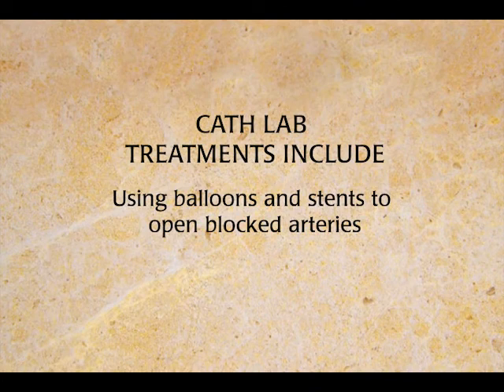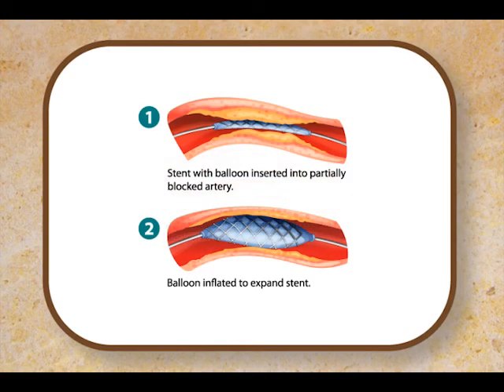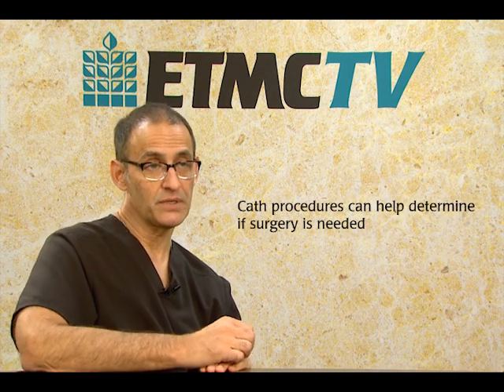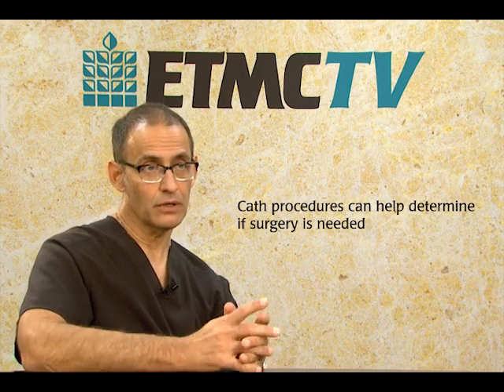If a patient comes in and is having chest pain, they've got a pretty typical history. They have maybe a stress test beforehand that shows that the front wall of their heart is deprived of blood flow. If you saw a high-grade blockage in that artery and it looked like something that was appropriate to fix with a balloon or a stent, then you have all this background information at that point to fix it. Or perhaps we have to call a surgeon up to say, let's consult about this particular patient, come take a look at these films that we've got and see what you think about cardiac surgery.